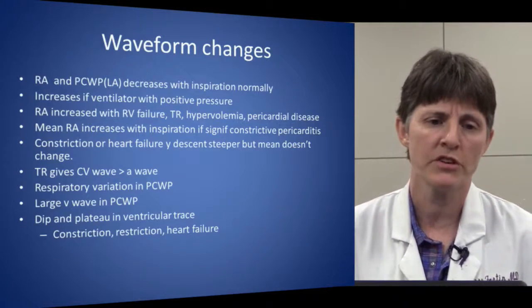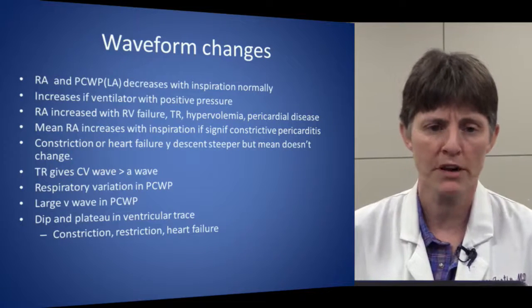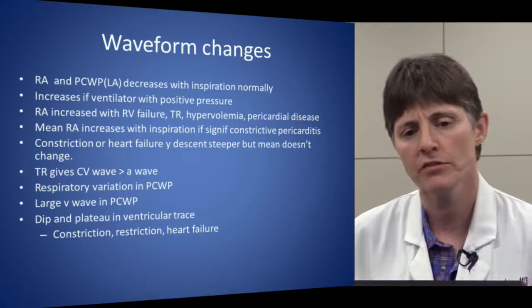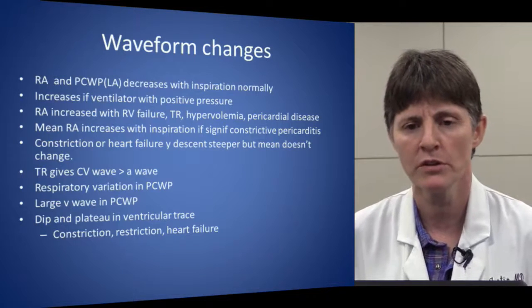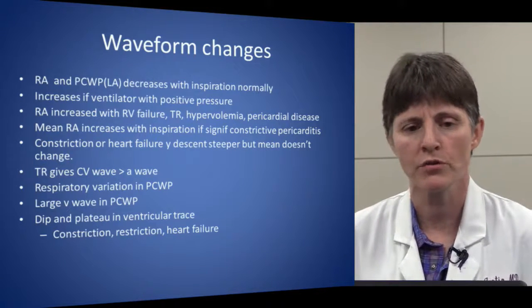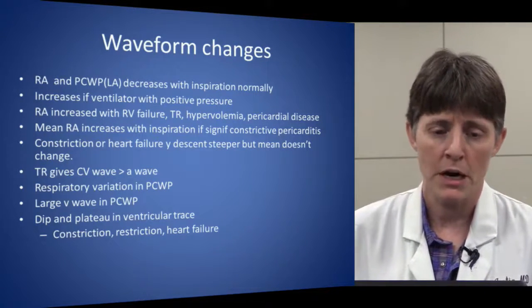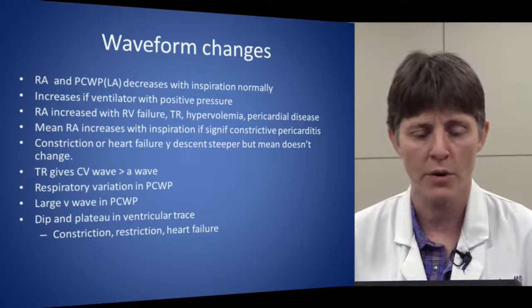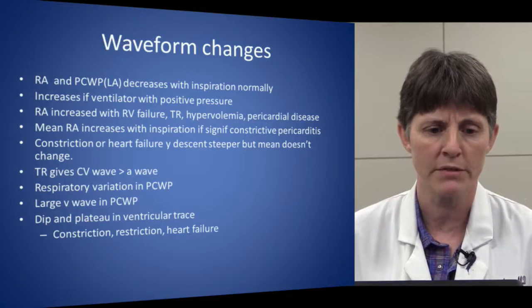At end expiration is where we should really measure the pressure. If the patient is on a ventilator, that's opposite. So there's positive pressure ventilation. So when they inspire, pressure is going to increase a little bit. Other things will change, and again, the steady state that's going on will be very relevant.